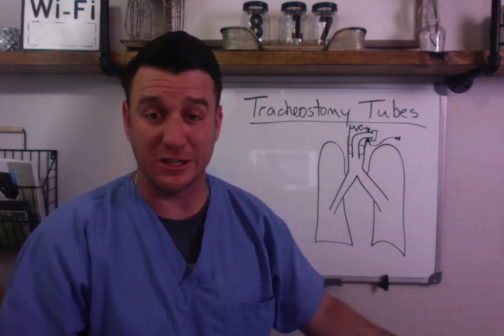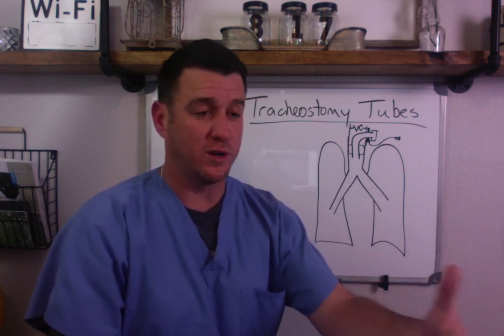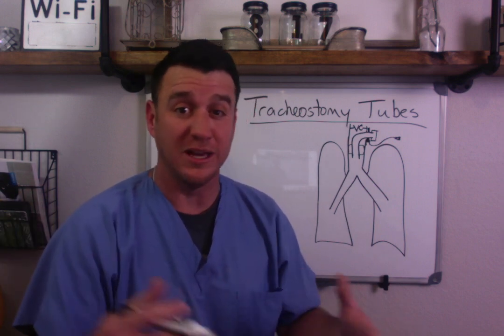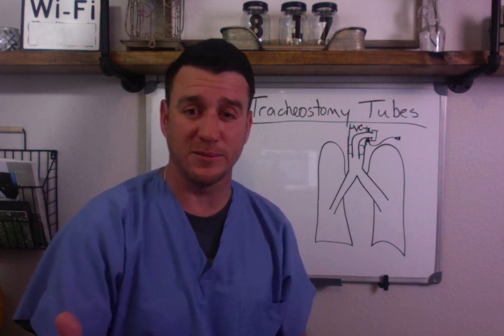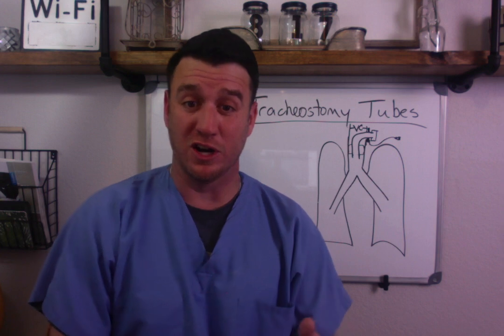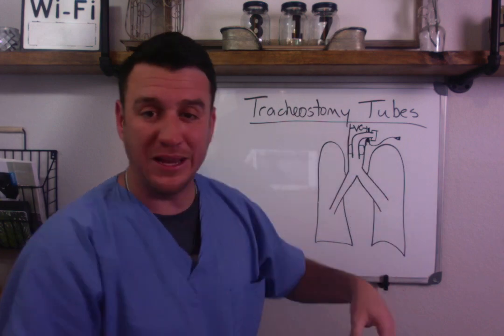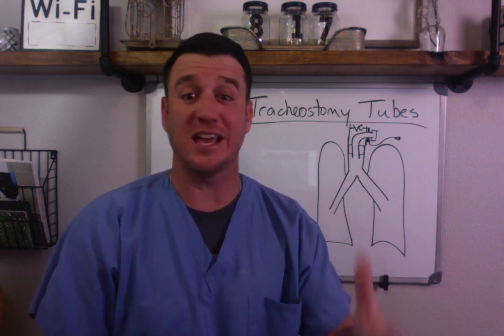Now, this is no different than an endotracheal tube. If you have an endotracheal tube, you're shooting for 20 to 25 millimeters of mercury, 20 to 30 centimeters of water pressure. Try not to max 30. If you need more than 30, 40, 50 centimeters of water pressure, you probably have too small of an endotracheal tube. Same story with tracheostomy tubes. Same cuff pressures, 20 to 25 millimeters of mercury, 20 to 30 centimeters of water pressure. Holding at that 30 centimeters of water pressure is what they show as best outcomes. That reduces the amount of biofilm aspiration, but also occludes the airway without impeding blood flow, lymphatic blood flow to those regions. Okay, so they found that 30 centimeters of water pressure is a safe cuff pressure.